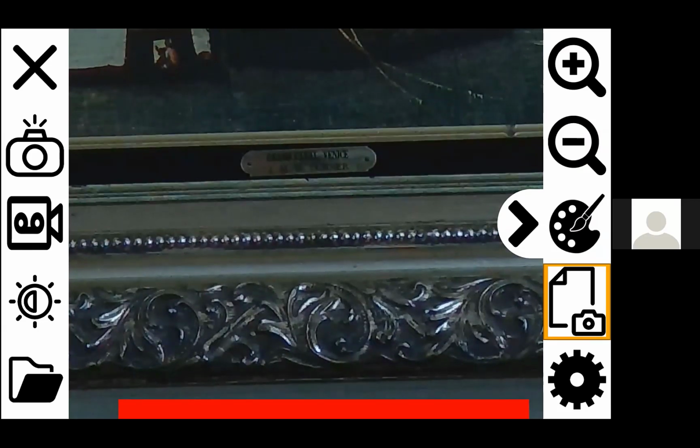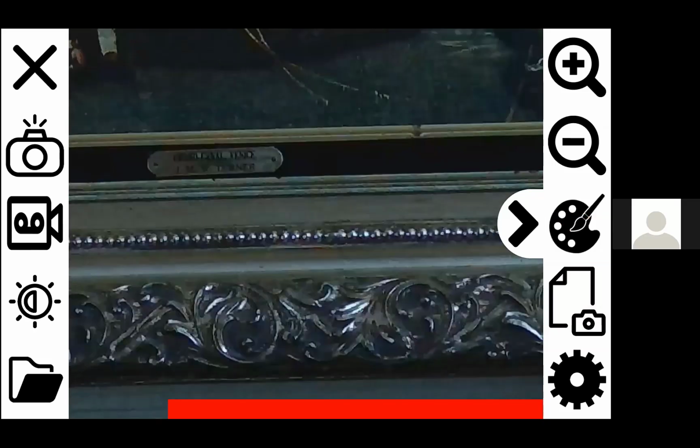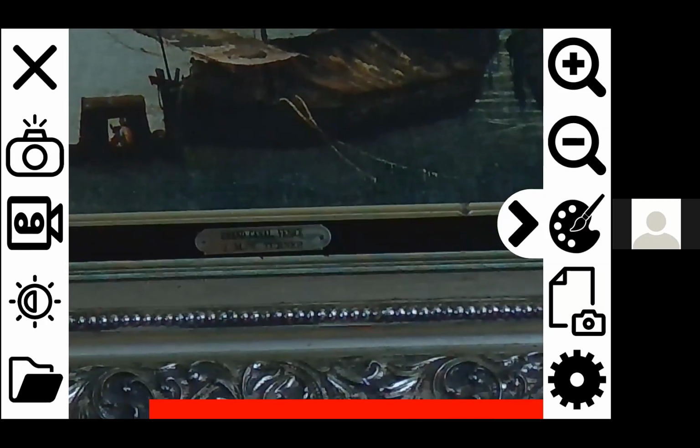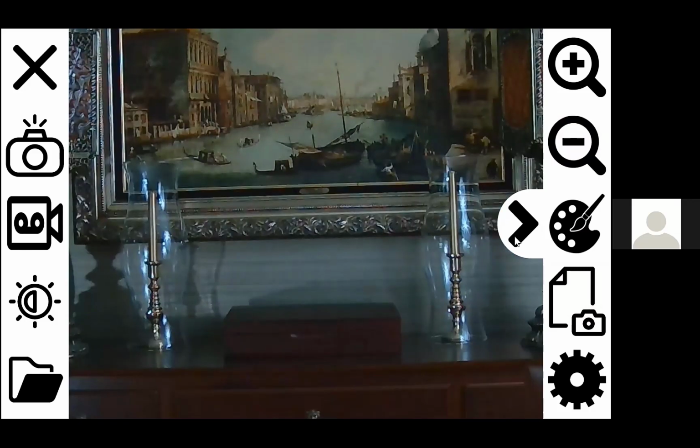What that red bar is letting you know is that you've gone through your optical zoom and you're now into a digital zoom, which will allow you, and I'm touching the screen right now, and I'm actually able to pan across on this image that I have on the screen. And when I zoom out, that red bar goes away. So that's really, oh, go ahead, Richard.